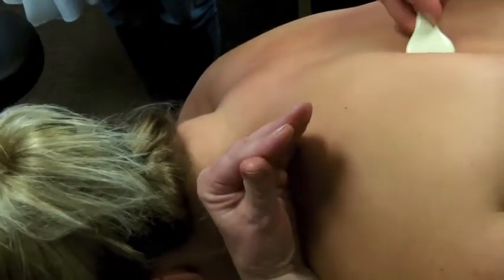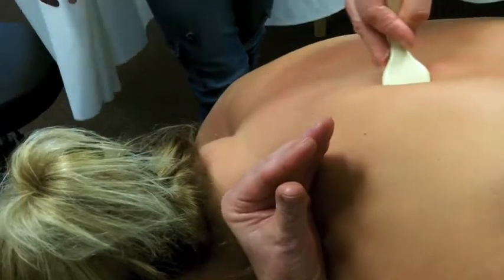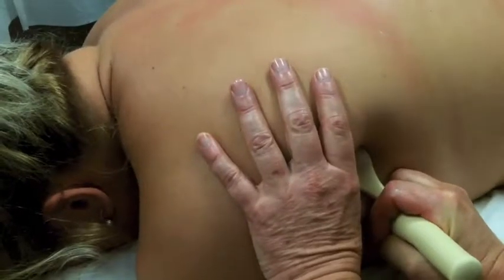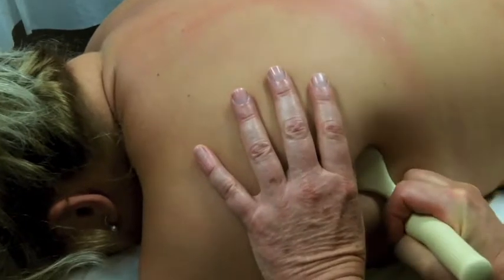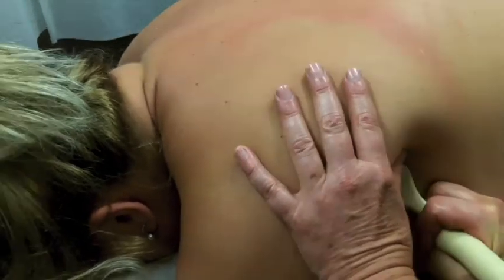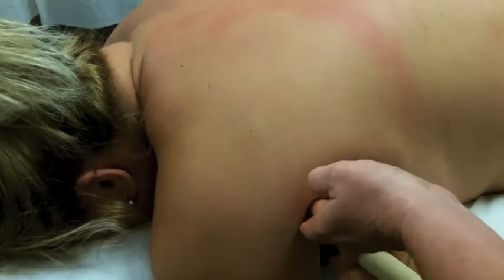But this is the furthest we've ever been able to get under with the tool. Yeah, because you can't use your hands to get in there. If you lay the person on their side and they actually support the arm, you can pull it towards yourself and get in even better. You can't get up there with your fingers, and because of that many therapists just don't treat it — it just hurts them too much, so they don't do as good a job as they could.